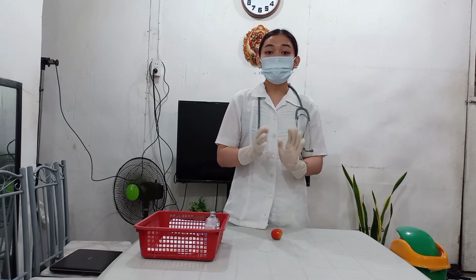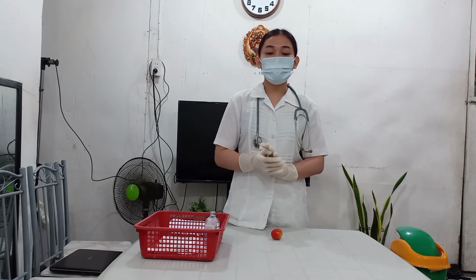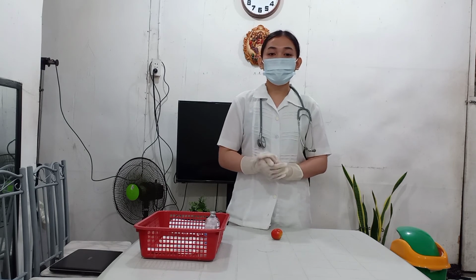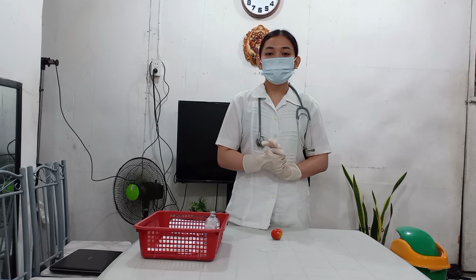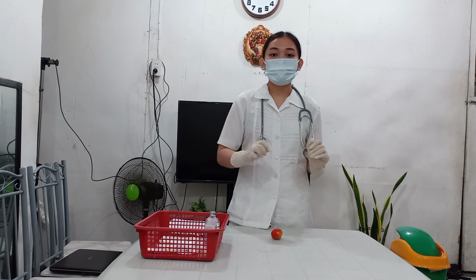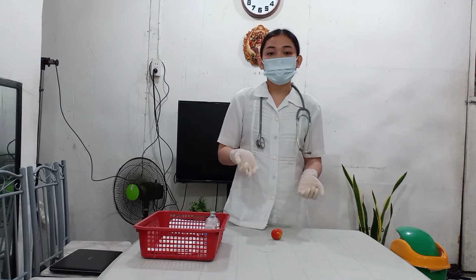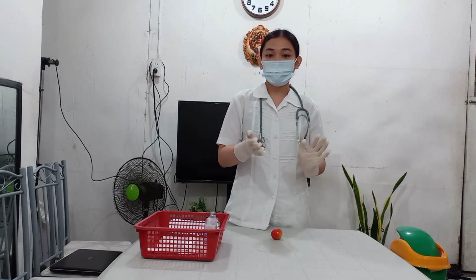We use a circular motion starting at the center and move outward about 5 centimeters or 2 inches and allow the skin to dry because cleansing the injection site prepares it for injection. And cleaning in a circular motion moves pathogens away from the injection site. Alcohol also gives full play to disinfect after it has dried.